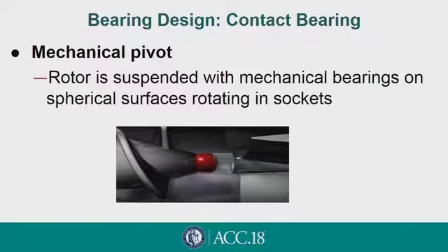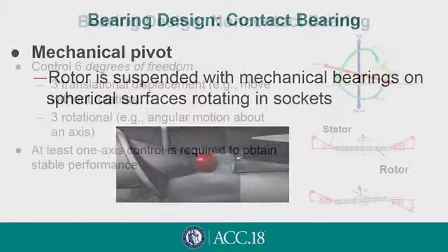It represents a point of friction. And in order to dissipate heat, you need a continuous source of blood flow to prevent heating of the bearing. And the bearing actually rides on a thin film of fluid, so there's not actual direct contact between the bearing and the cup. These are made of unique materials such as quartz, and they're very resistant to wear. And so these types of pumps, although they are mechanical in design, can last for years and years and years. But they do have the limitation of friction.